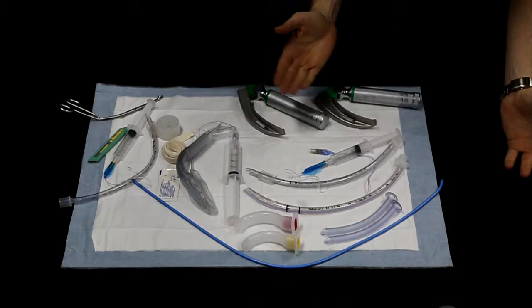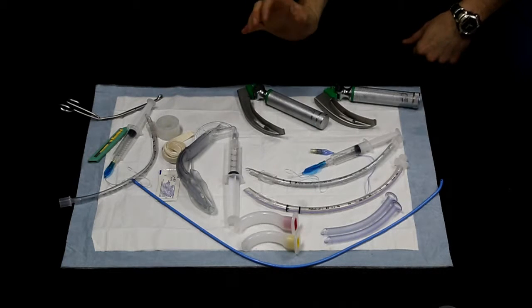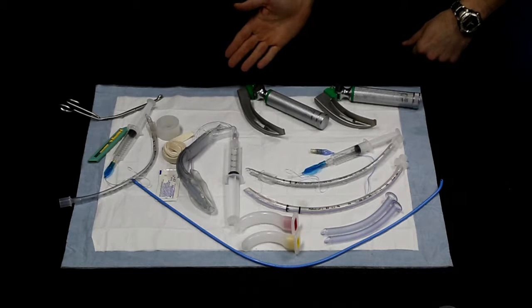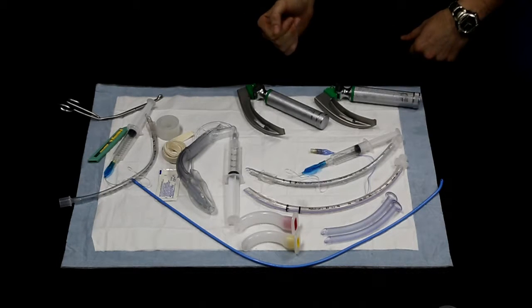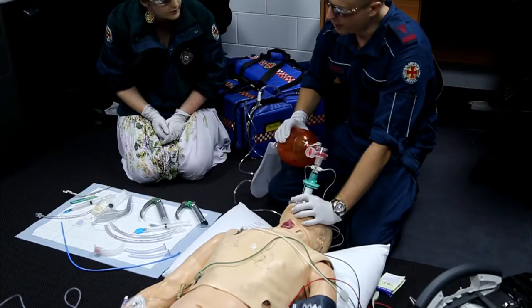Failing that, the alternative supraglottic airway, so in Queensland we use the LMA, again tested and syringe attached, tie, lube, tape, and then finally the surgical airway, which again in Queensland we use a size 6 tube with a scalpel and a bougie.